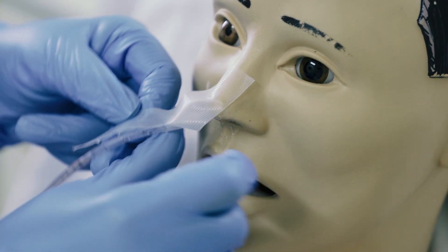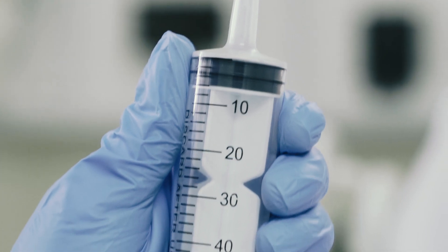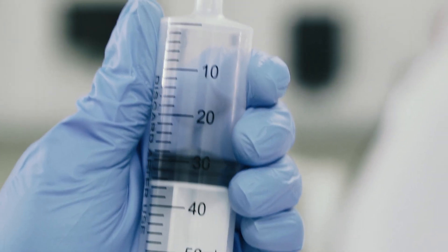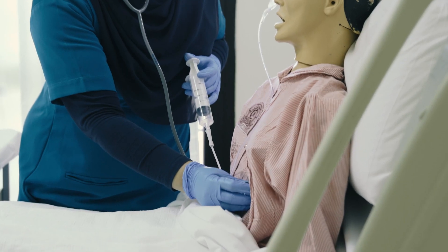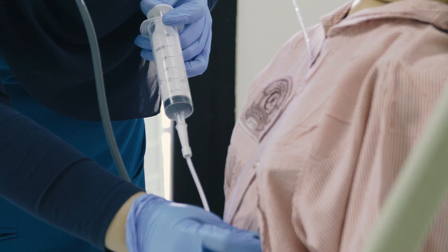Secure the tube with adhesive tape. Put on the spigot. Then check the placement of the tube using the stethoscope by pushing about 30 ml of air and auscultating the stomach.